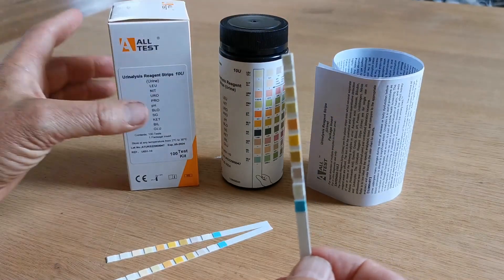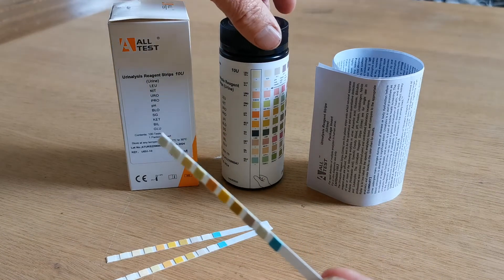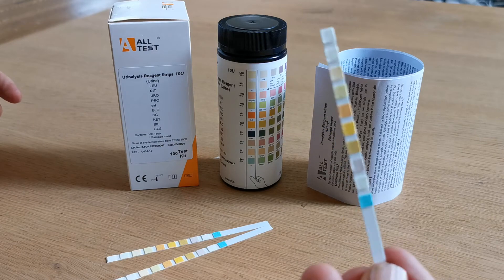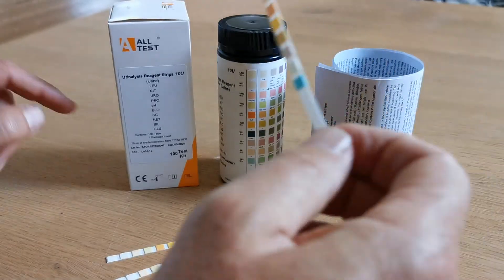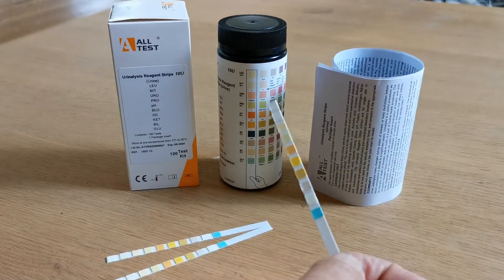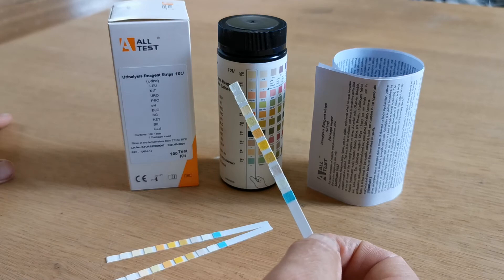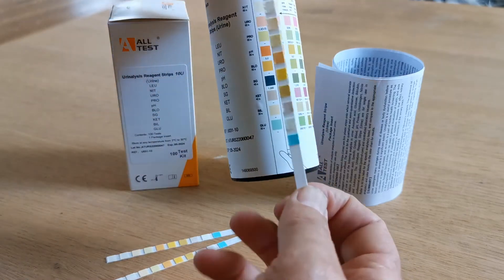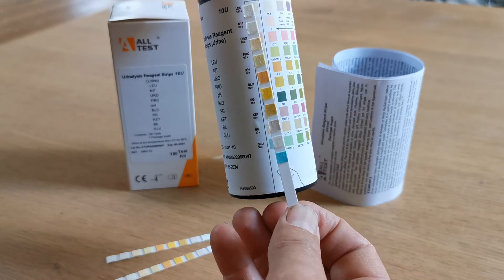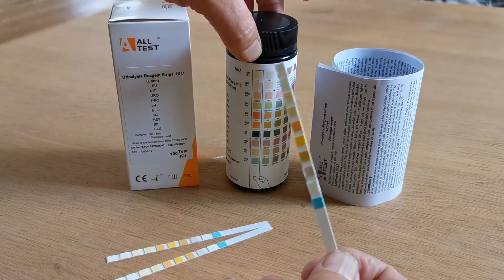To perform a test: the pack is opened, foil broken, a test strip removed, and the lid placed back onto the vial. The test strip is then inserted into urine and when it is removed, it is just dipped against the side of the container to prevent any leaching of these pad dyes. Then the interpretation of the result starts with the matching against this colour pad at 30 seconds, and the last one to read at 120 seconds is your leukocytes result.